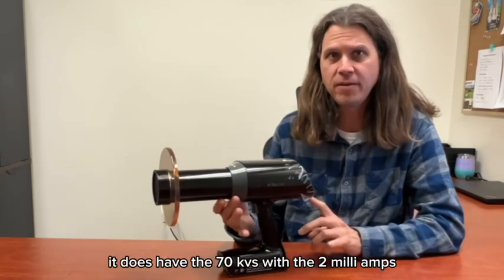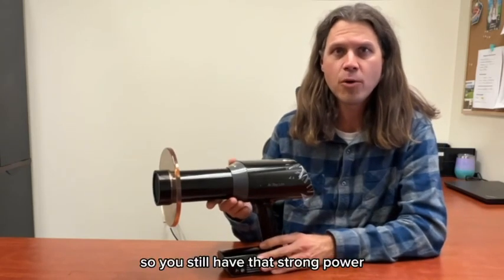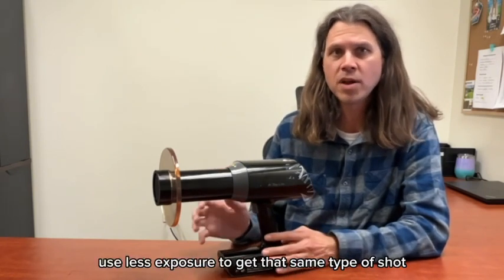It does have 70 kVs with 2 milliamps, so you still have that strong power over some of those other units, which allows you to use less exposure to get that same type of shot.